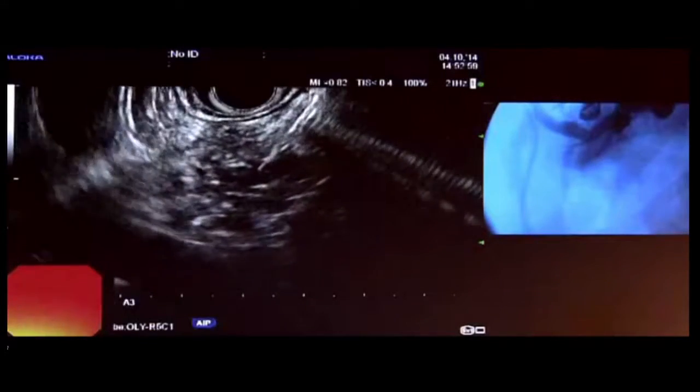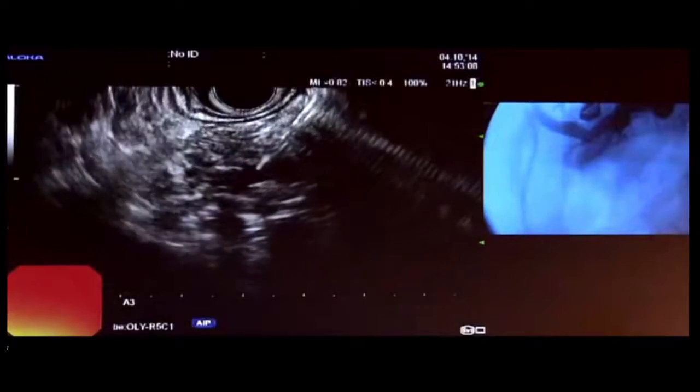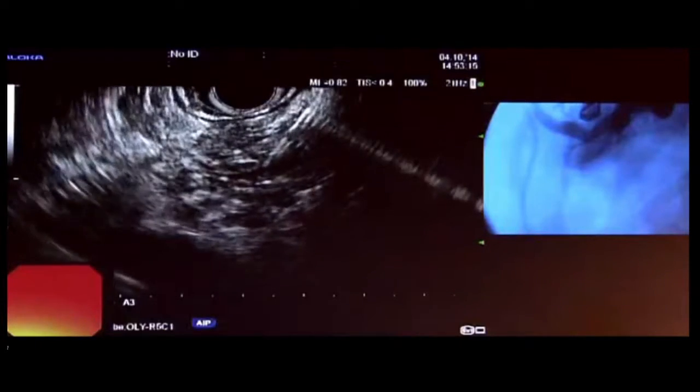This is pretty much the point of no return now, right? We filled our duct with contrast. Oh yes. I mean, we could aspirate the contrast out. That's not a problem. But yes, I mean, right now we're going to hope that we can accomplish the rendezvous. And a mundane question: did you give her antibiotics? Oh yes, always. You got antibiotics before the procedure.